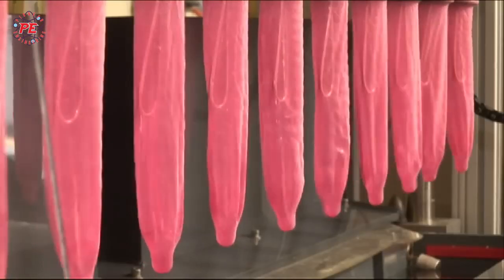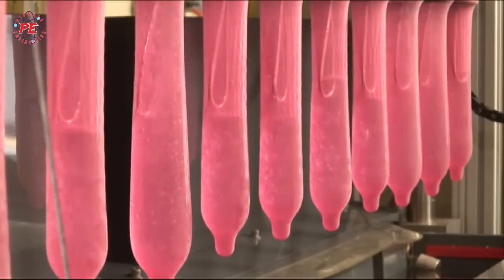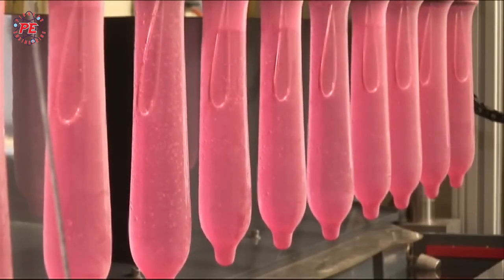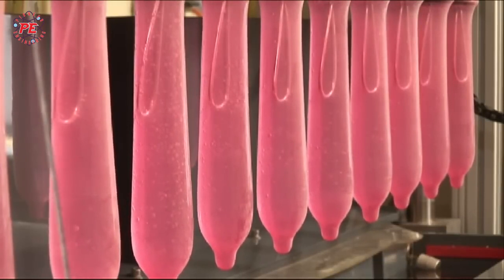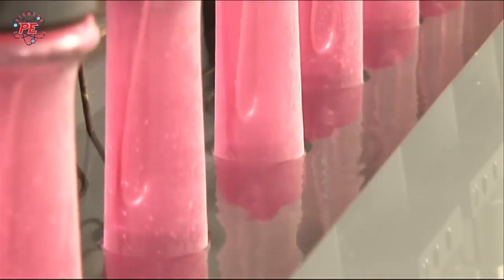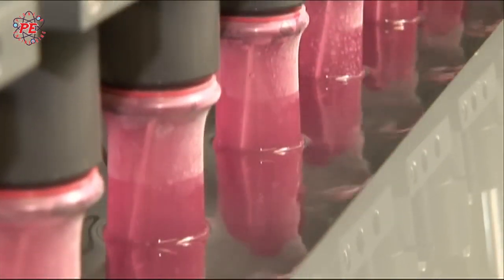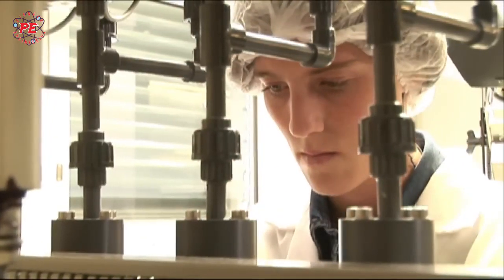The final test of the series, the pinhole test, will complete the other tests. Several sample condoms are placed over an electrical conductor and filled with water. Then they are dipped in a water-based solution to check if the condom being tested has a pinhole. If an electrical circuit exists between the conductor in the condom and the voltage source, it means that one of the condoms has a pinhole. With this test, it is possible to detect microholes, where holes of this kind cannot be seen with the naked eye.